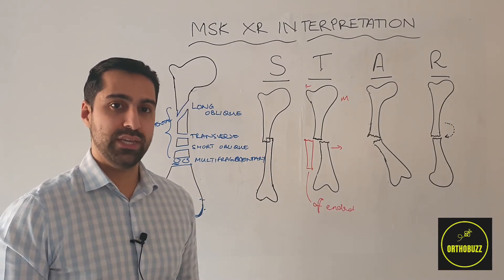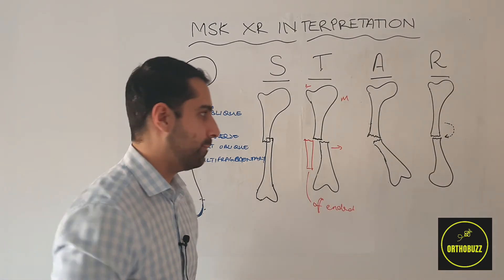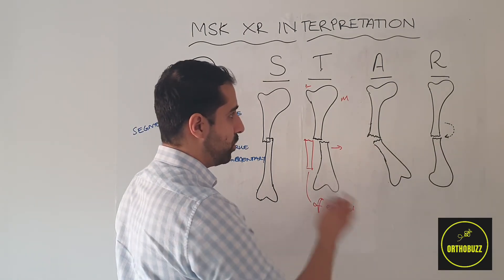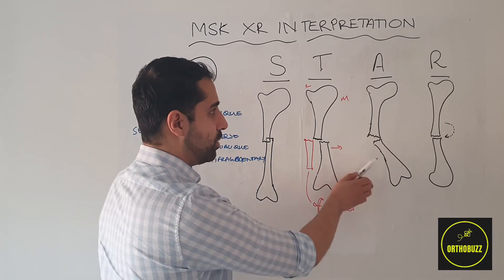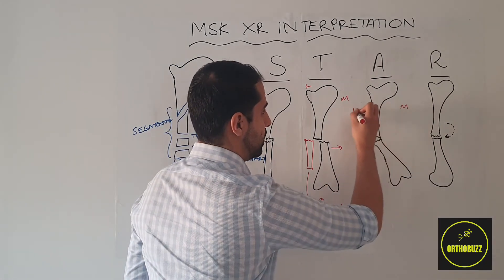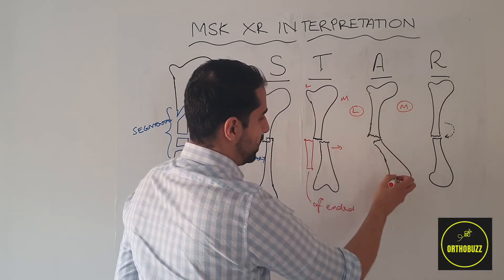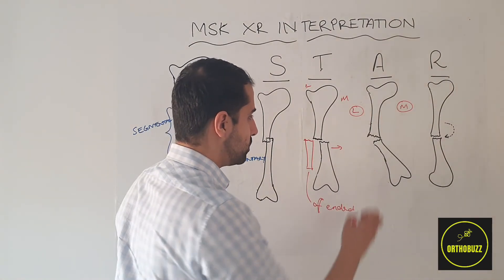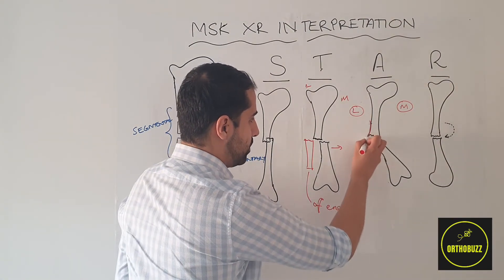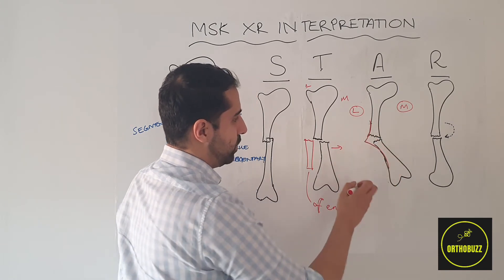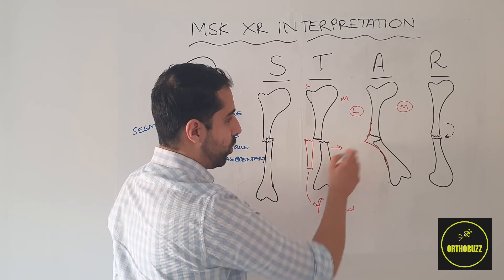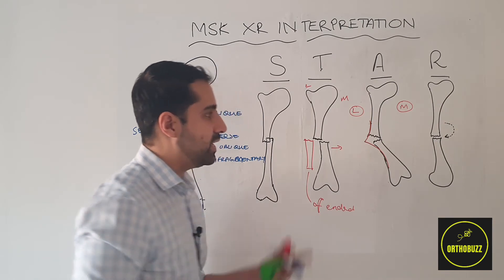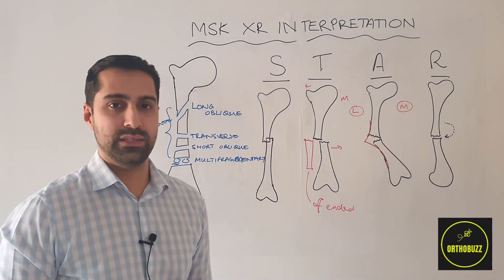Once we've looked at shortening and translation, we assess angulation of the fracture. Similarly to translation, we describe what the distal fractured part is doing in relation to the proximal part. In this example, the distal end is angulated medially in relation to the proximal end. You can also describe the apex of the bone — whenever there's angulation, there's always an apex or point. Here the apex is lateral. For ease of description, this is a medially angulated fracture.